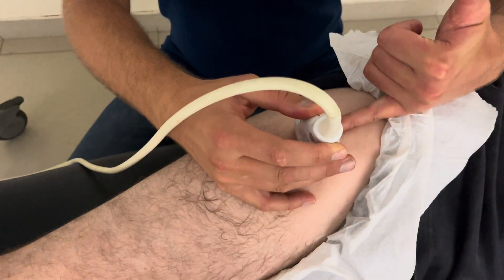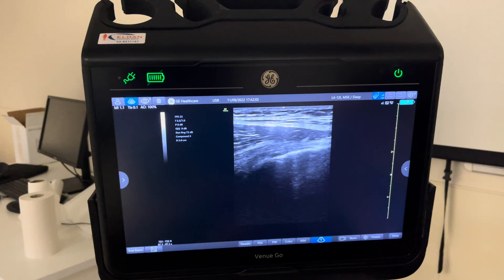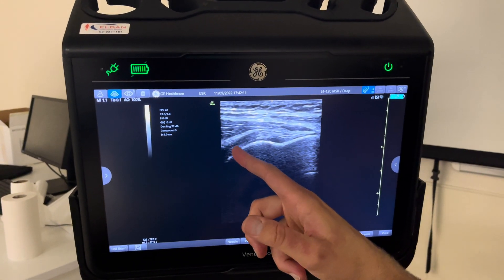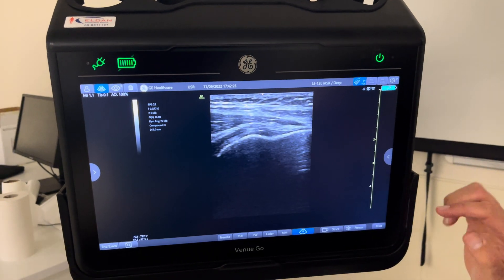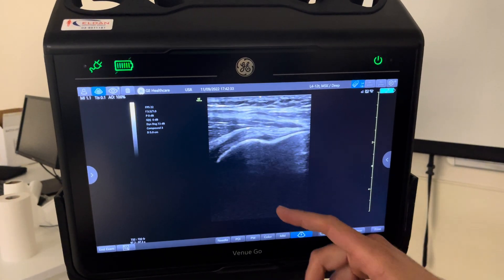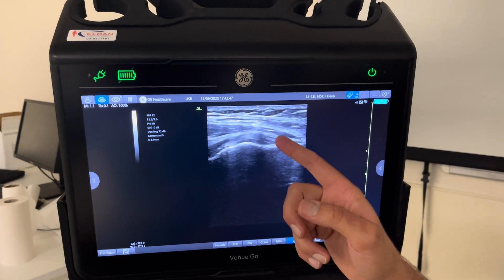For the long axis view of this tendon, remember it comes not from the midline but a bit anterior. So to scan it in a straight line, angle the probe in that direction with left being proximal — the official rule. Now we see a very nice view of the tendon. It's a bit dark proximally due to anisotropy, then it attaches from here to there. We can even see the bundles inside the tendon, depending on the machine. Here you check for any tears or possible tendinopathies, and you can follow it more proximally if needed — pathologies will be found right in this area.